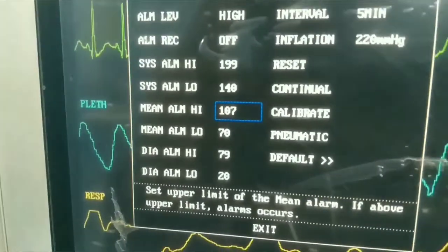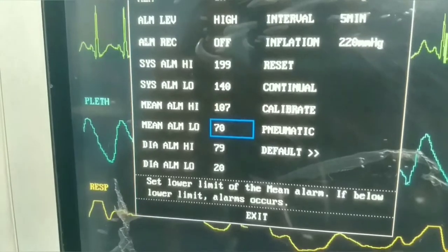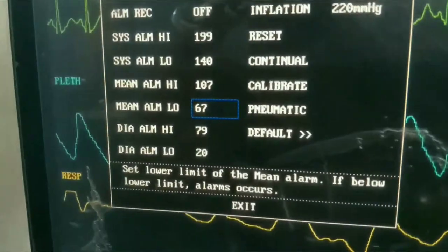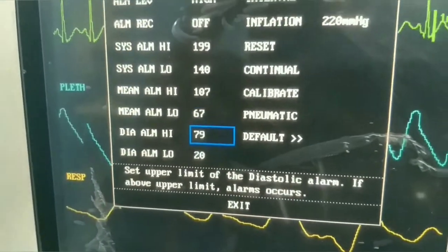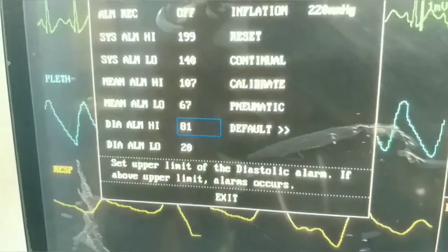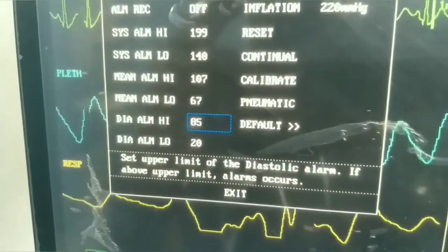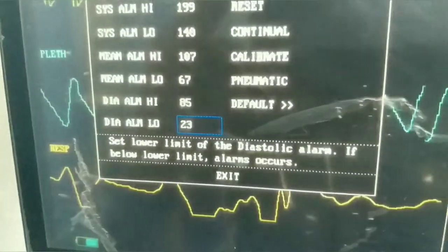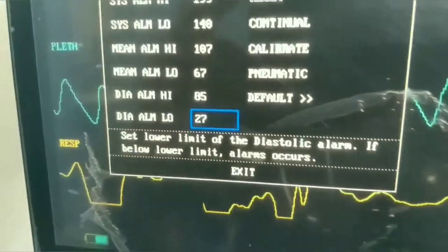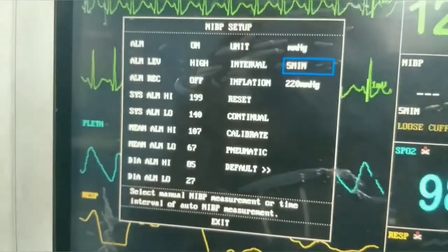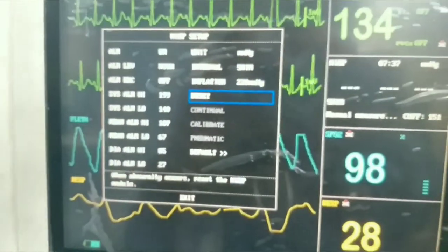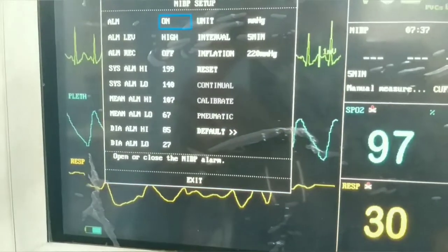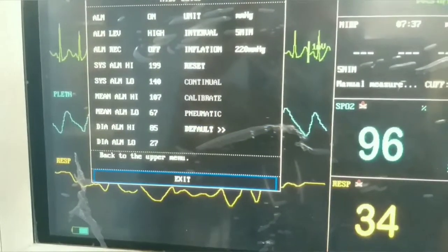Looking at these settings, we can see two extremes of the alarm — higher and lower. For diastolic, there is one high limit and one low limit. Now we exit out of the NIBP non-invasive blood pressure menu.